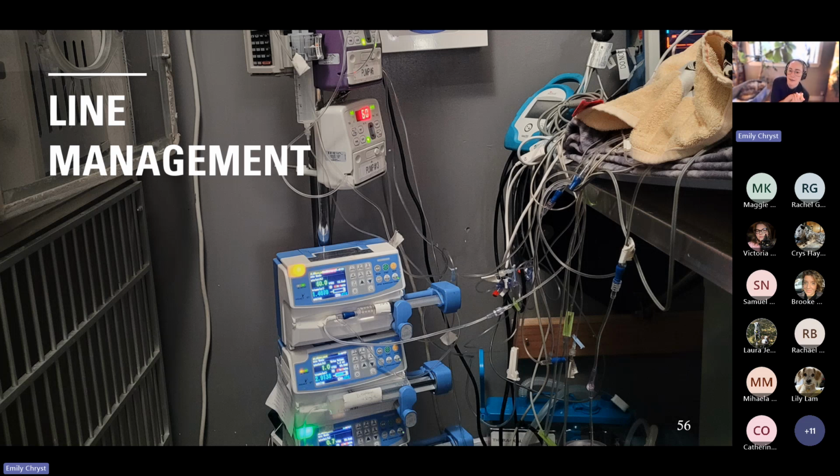But as long as you are regularly changing those ties as you should be, I have never seen an issue with tie gauze causing an infection. But again, they were changed every 4 hours. There's, I think, a trade-off to everything you're going to use. So good question. But yeah, I think umbilical tape has that same potential ability to really cut into the sides of the mouth. So you just need to be careful about what you use and think about the pros and cons and treat the patient appropriately.